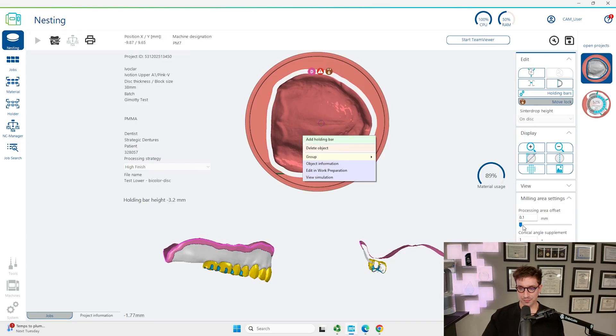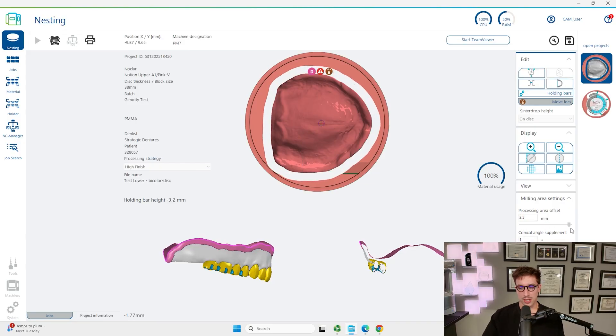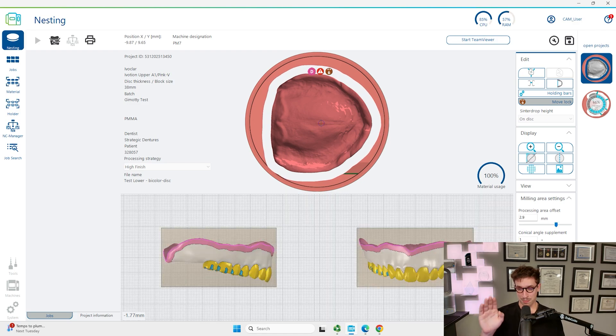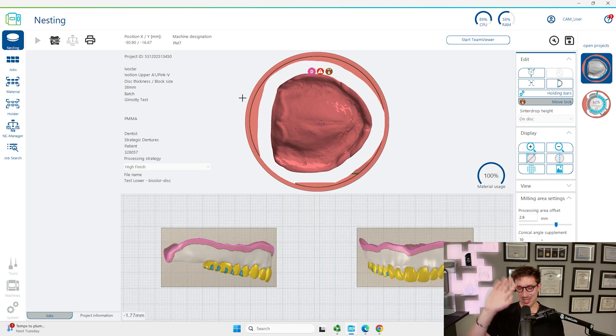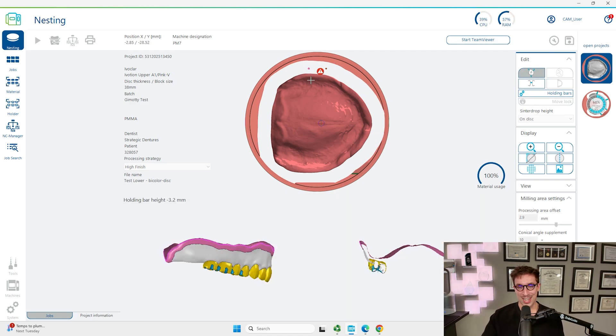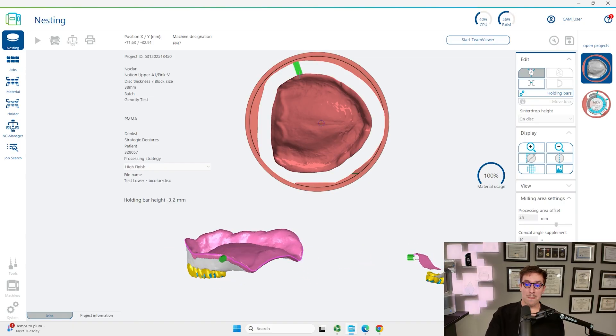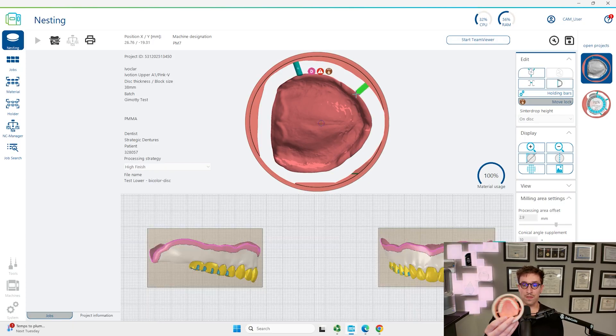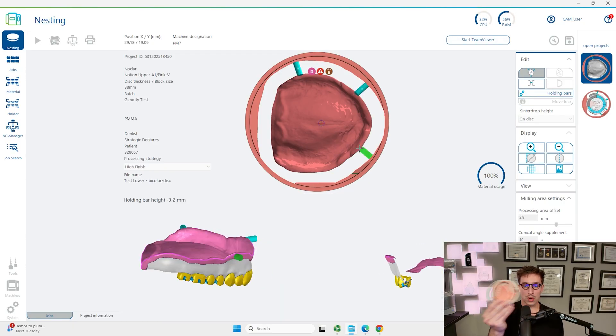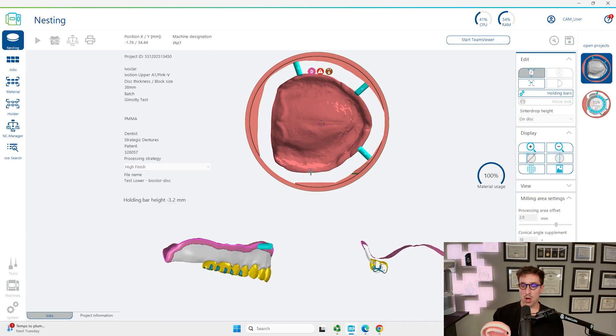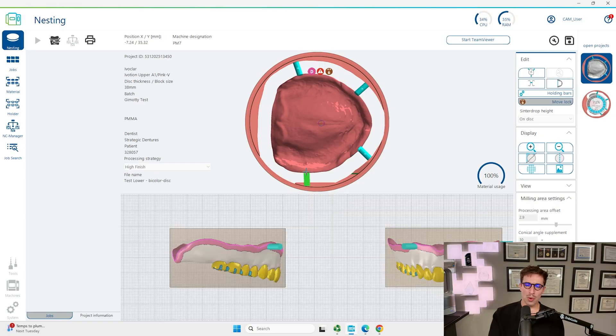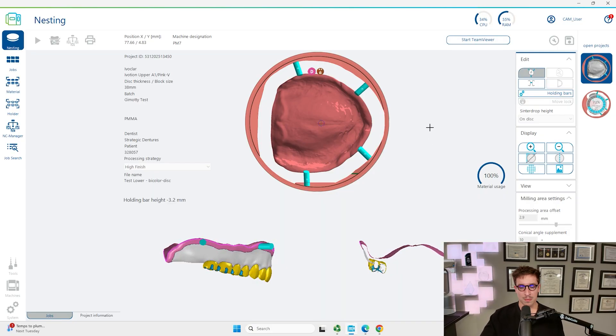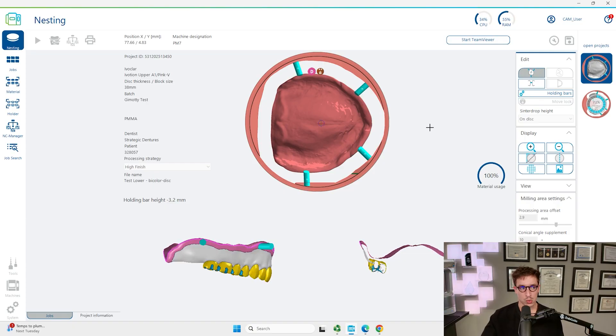So right click, we're going to increase the processing area offset. For the maxillary denture we're just going to put four sprues, we're going to put them all around, don't put one on the posterior border because that's extremely difficult to remove. A lot of times you're going to be removing some of the structure that you actually wanted to capture in the actual final denture for your patient.